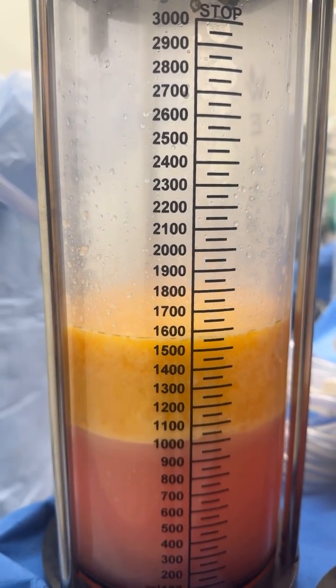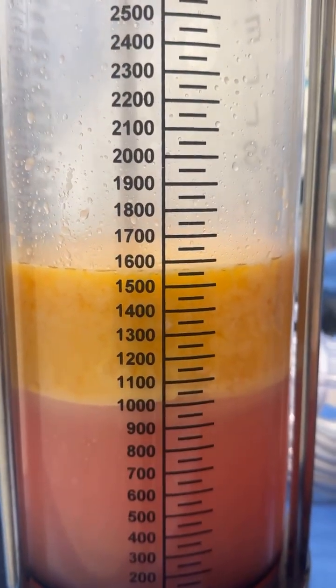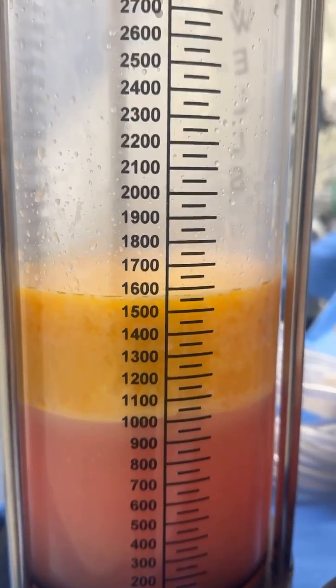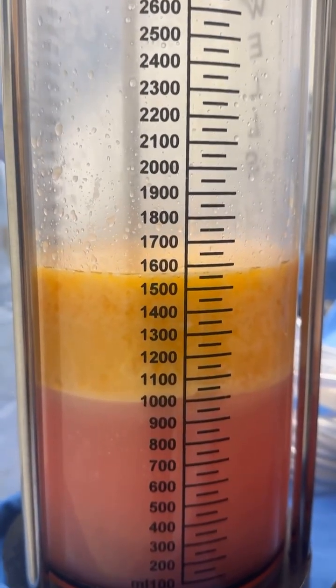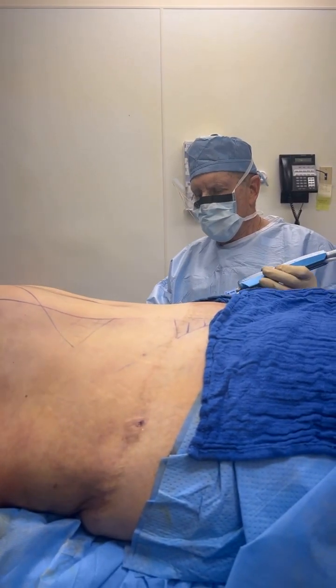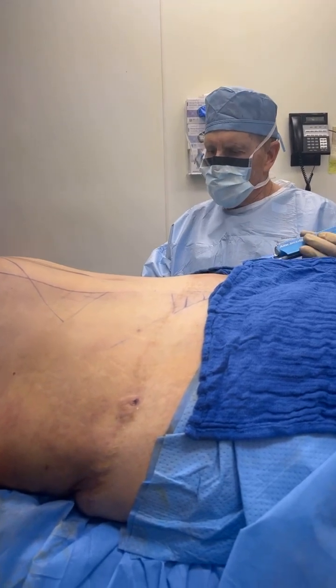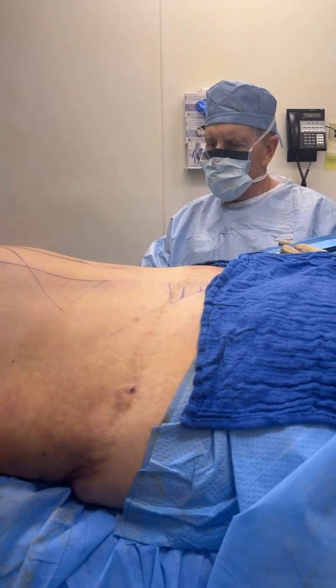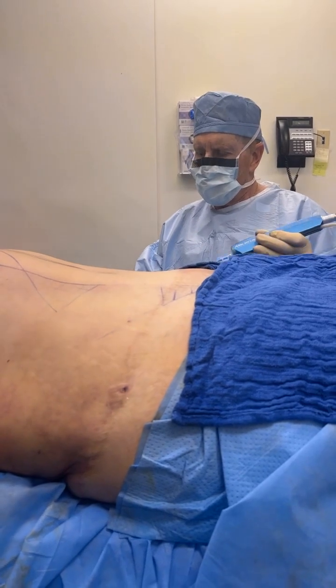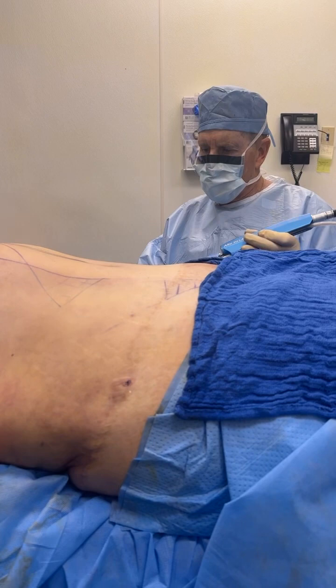So this fat is only collected in 500 ml of normal saline, and we don't process the fat at all. This is what's going to go into her body. Thank you. This is my non-dominant hand, and even for those surgeons that are not ambidextrous, you can do this because the strokes are very slow, very calculated, and so it gives you also an advantage for the surgeon.